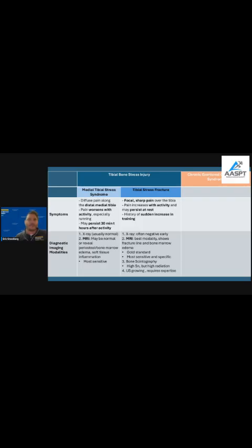in diagnosing these things. Now, Matt did a great job of reporting the role of ultrasound in his patient with tendinopathy, but there is some growing evidence of the use of diagnostic ultrasound in the diagnosis of bone stress injuries. The problem with diagnostic ultrasound is that it's very user dependent. It's quick, it's affordable. However, the expertise of the operator can be quite a limitation.